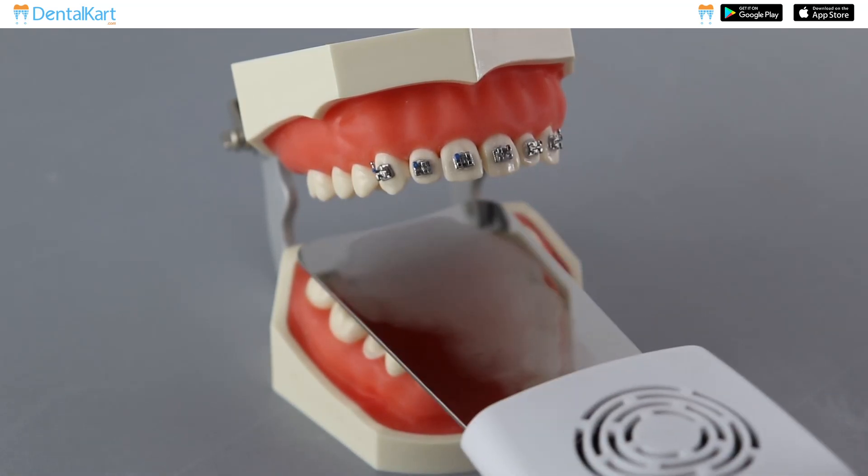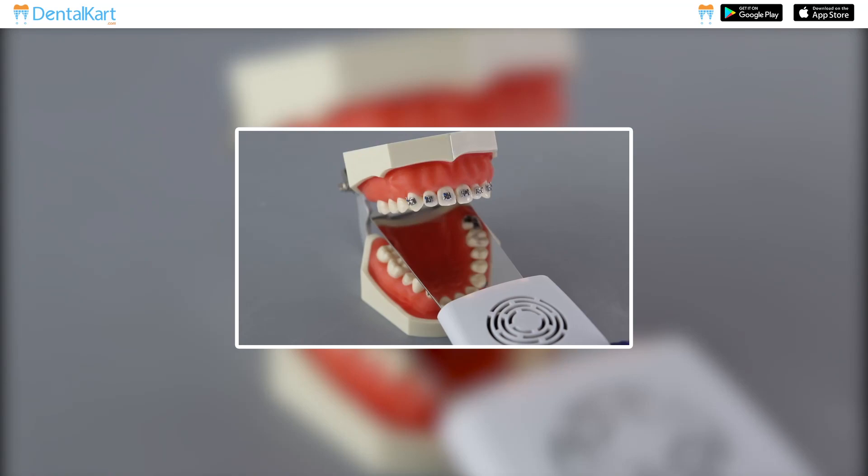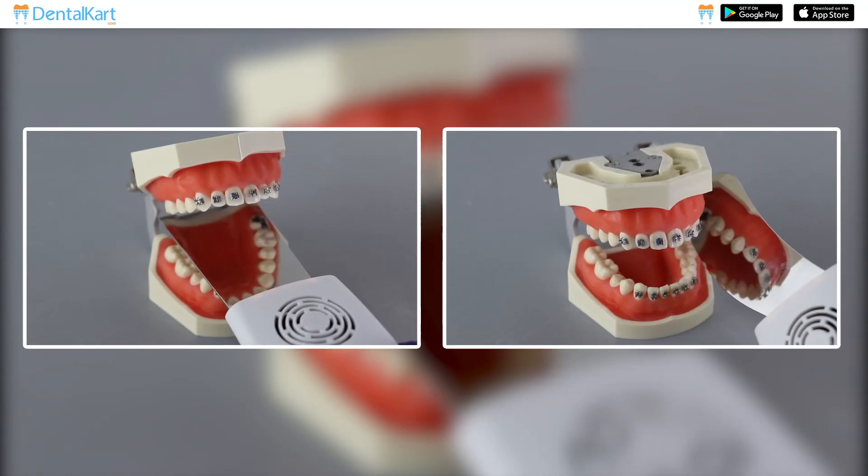Position the mirror accordingly and use its anti-fog feature for a clearer view. Take the photograph. Repeat these steps for any additional photographs you need to take.